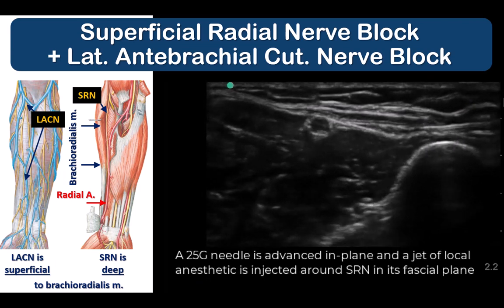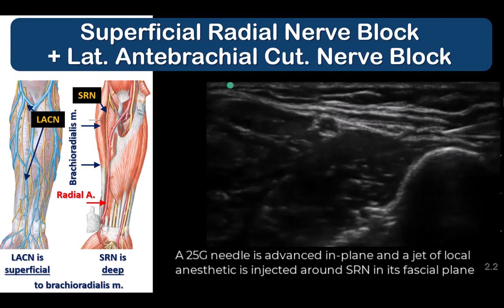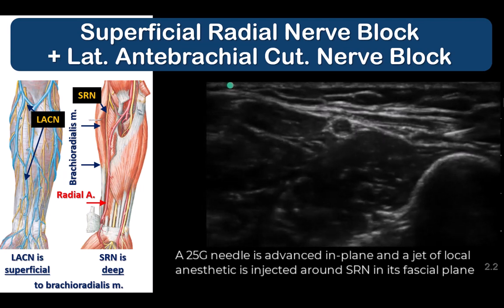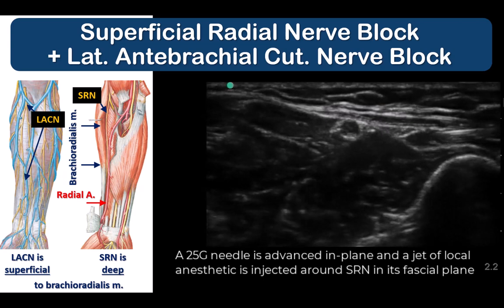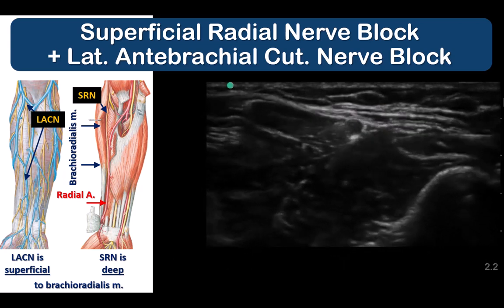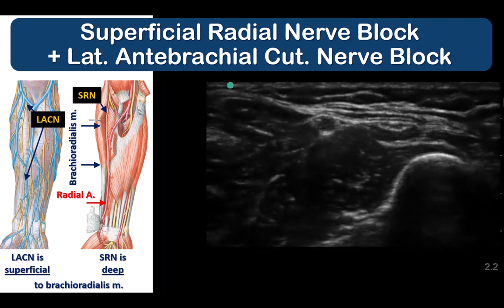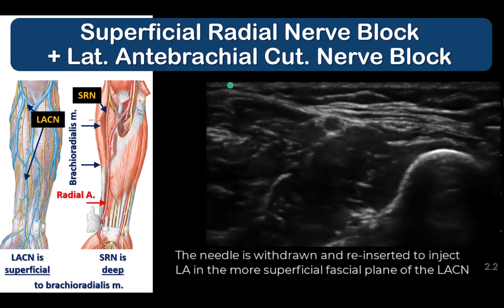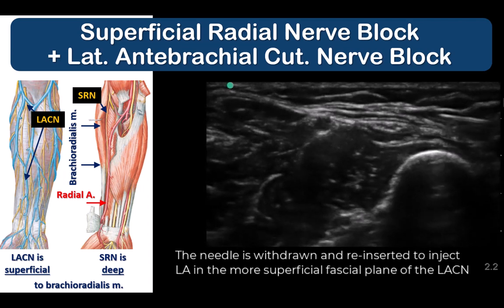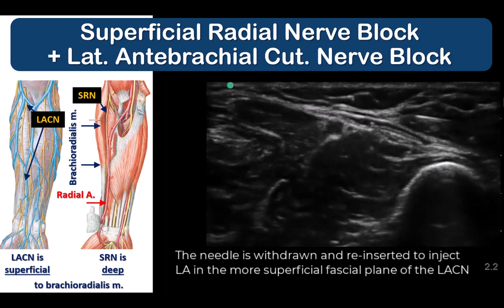Insert the needle into the fascial plane under brachioradialis and open it up with a jet of local anesthetic to surround the superficial radial nerve. Withdraw the needle and perform a similar injection in the more superficial subcutaneous layer above brachioradialis muscle and its tendon to block the LACN, and thus ensure anesthesia of the area around the base of the thumb.